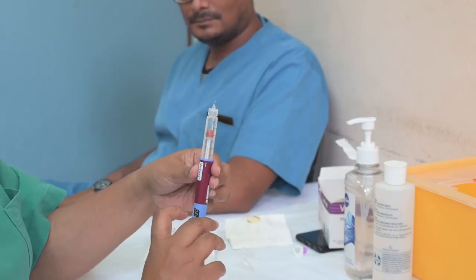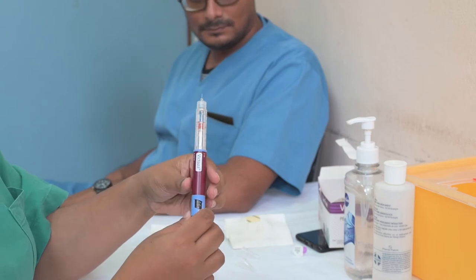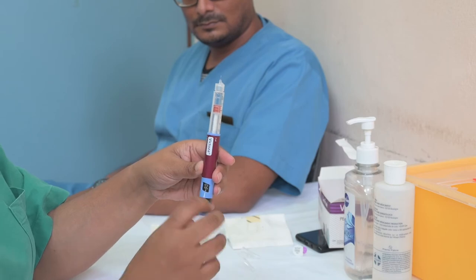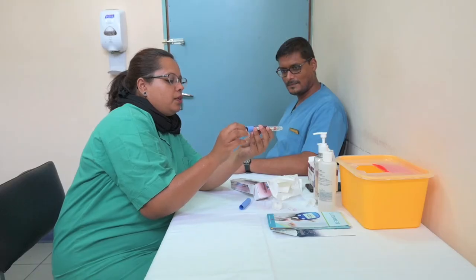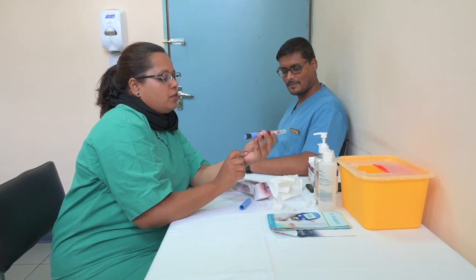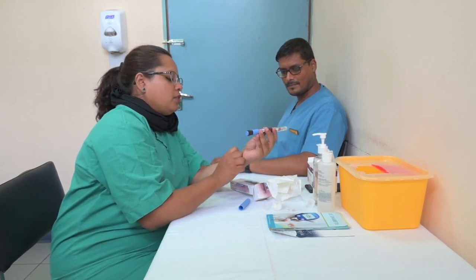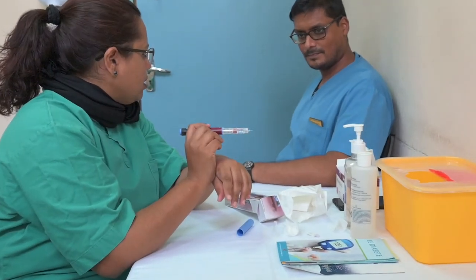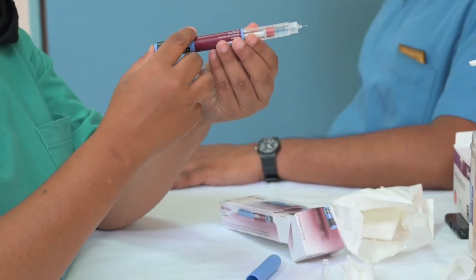You have to check the prescription, the prescribed dose for the patient. Okay. Here you see the dosage, and you roll the knob till the dose required. For this, normally if it's 0.6 milligrams like this, then you just inject at a 90 degree angle, then you just press it like this.